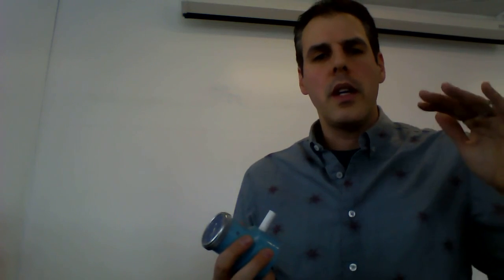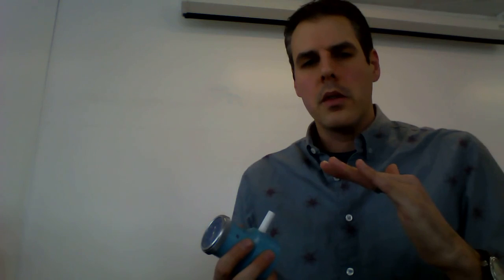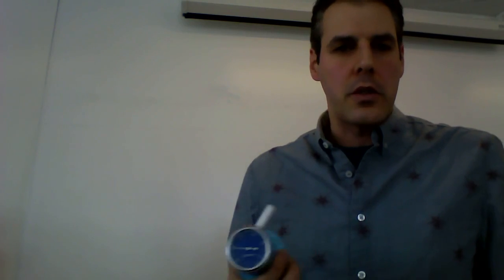We can do an ERV, expiratory reserve. So we want to breathe out a normal breath, hold it, and then breathe the rest out. So I reset it, breathe out, hold it, and then I empty my lungs from there. For me, it's about 2 liters. That's an example of the ERV.